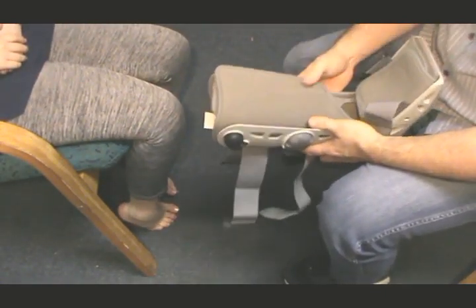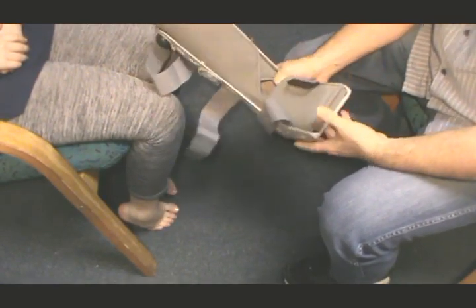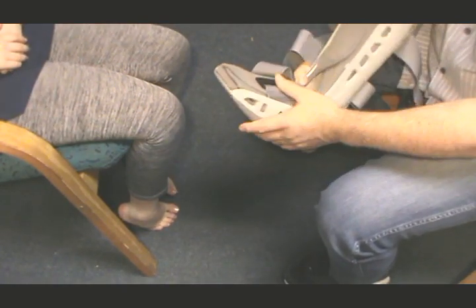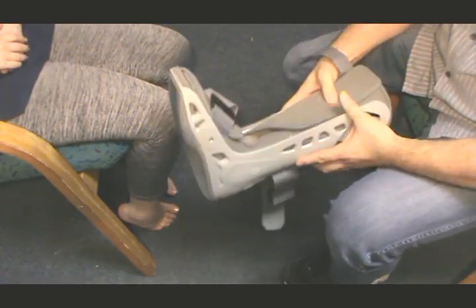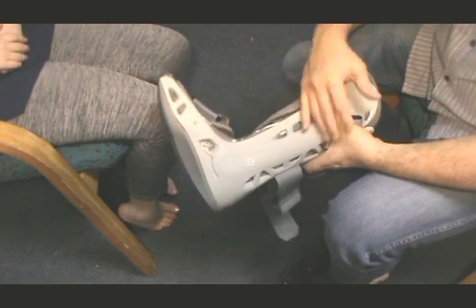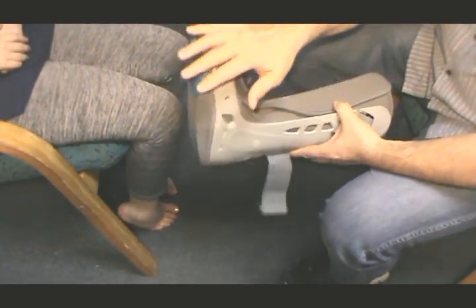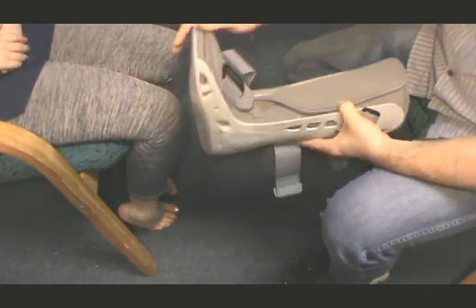Another small tip is that at night when you're sleeping with this boot, because it's got a bit of rubber here, it can hook onto all your bedding. So what I found that I can suggest is that maybe get a pillow slip and pull the pillow slip over the boot and tuck it in, and then the pillow slip will stop the duvet and the sheets from hooking onto the boot.